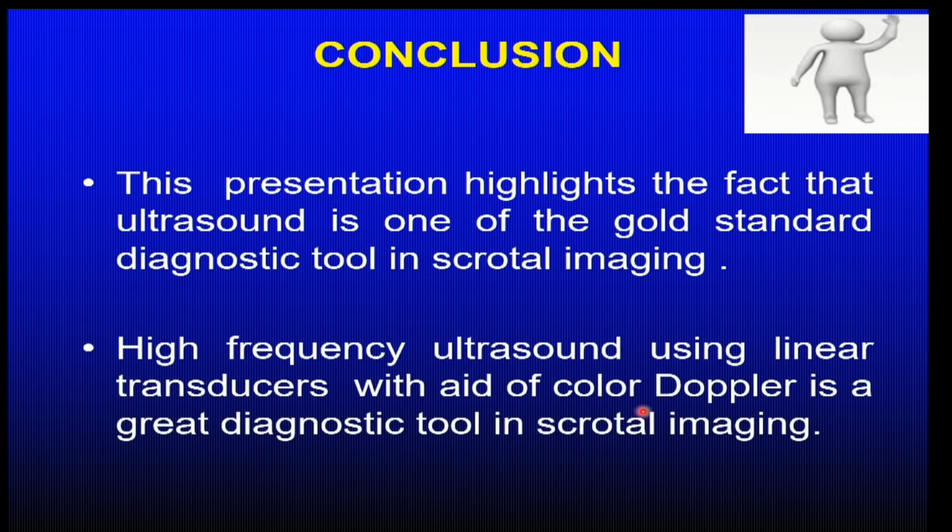So just to conclude, if you have a systematic approach, look at the clinical profile, lab investigations, a segmental approach to testes from outside to inside, you can almost, with a high frequency transducer, make beautiful diagnosis of day-to-day acute scrotum in clinical practice. Now, this is one part of acute scrotum. Other than that, you might encounter scrotal imaging for male infertility.